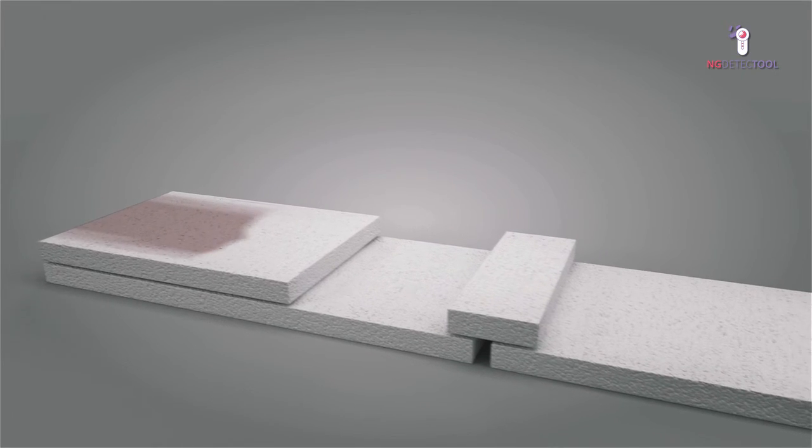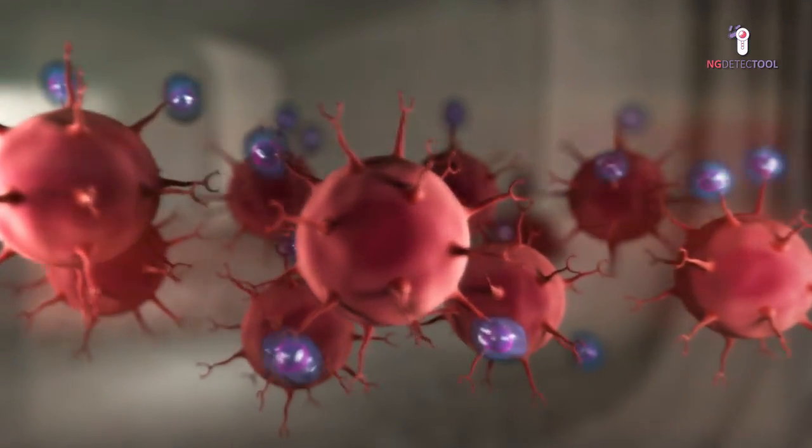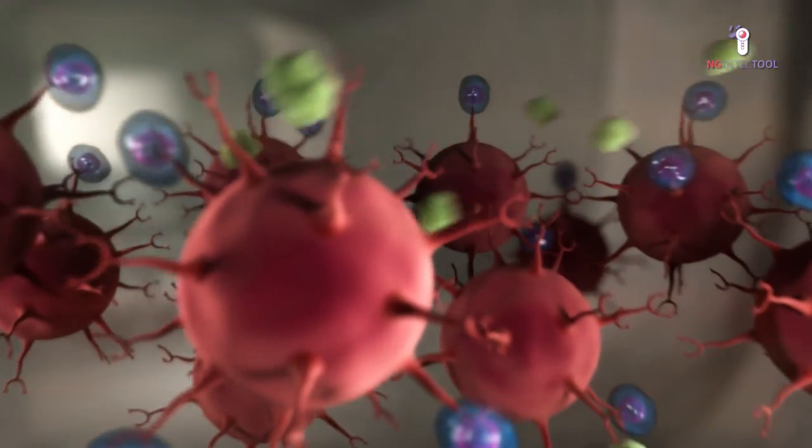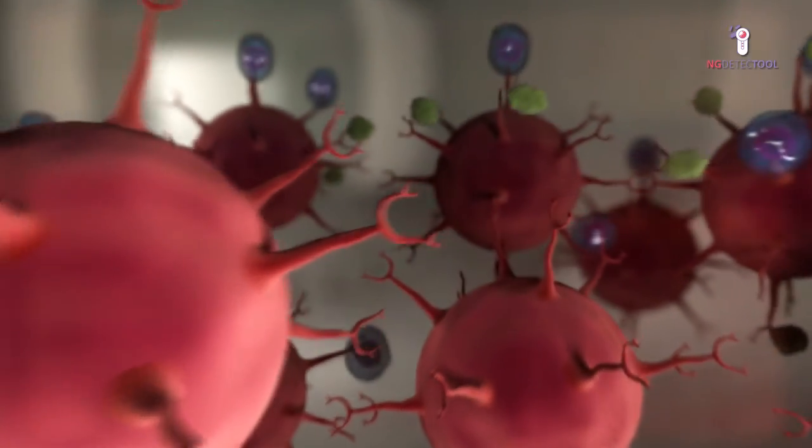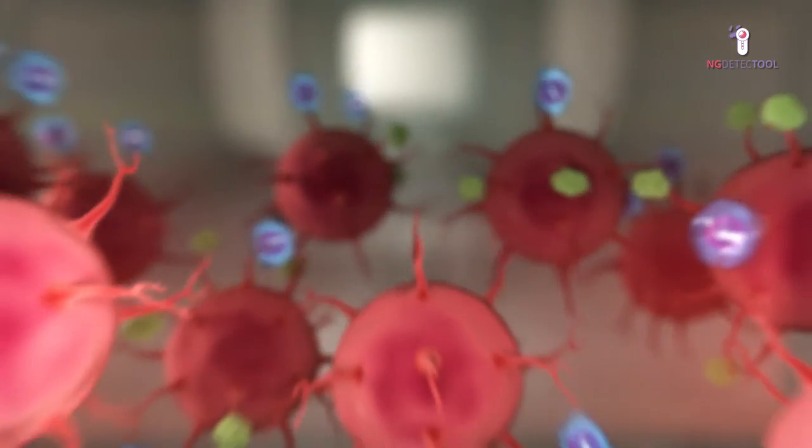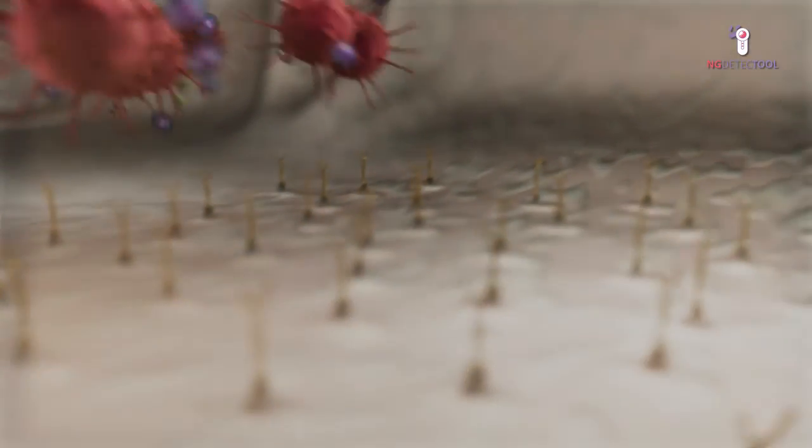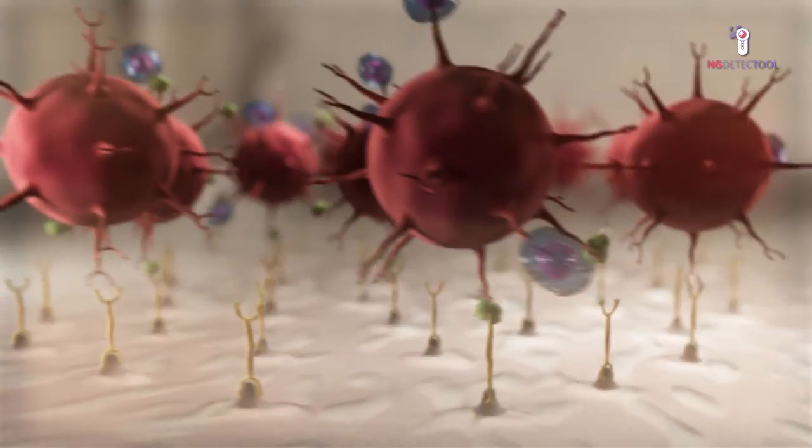When the sample is in contact with the strip, it flows along, passing first through the pad where the conjugated antibodies are located. If the antigen is present, the conjugated antibodies will bind to it and continue to migrate along the strip. These antibodies will recognize the test line and a colored band will appear.